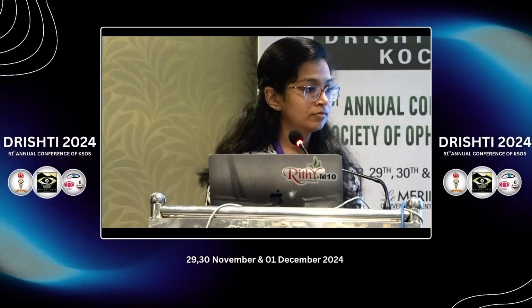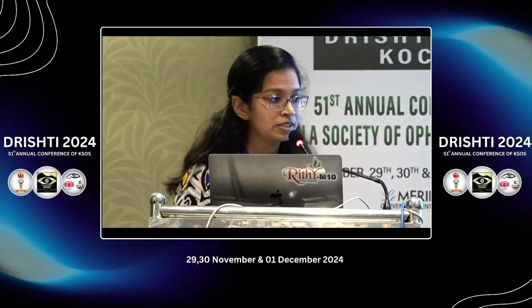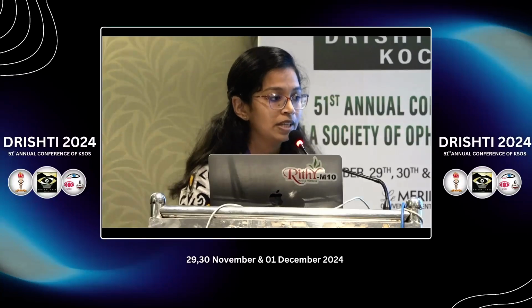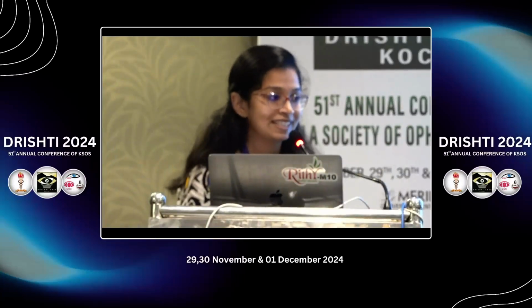You suggest OCTA in every cardiac patient? Not every cardiac patient. If he is having symptoms, mild symptoms or doubtful symptoms, we can consider OCTA before doing the invasive procedure, which is also expensive. This will be used in follow-up. Yes, it is better. In my study, it is proved that it is better.